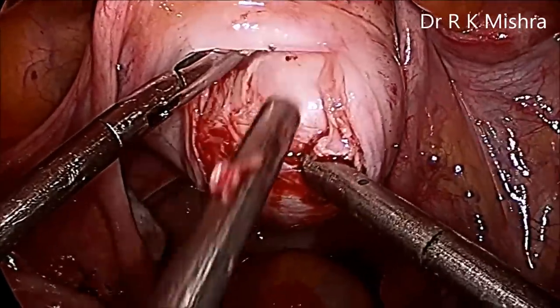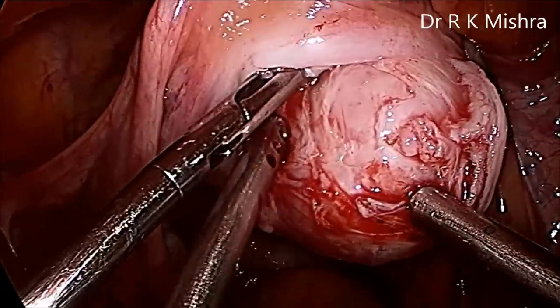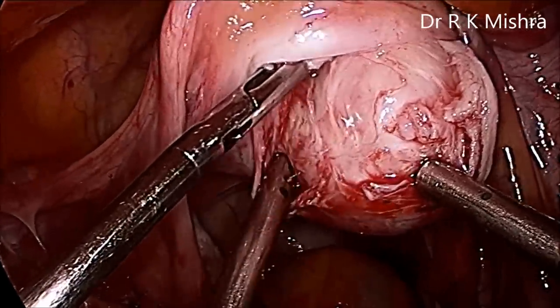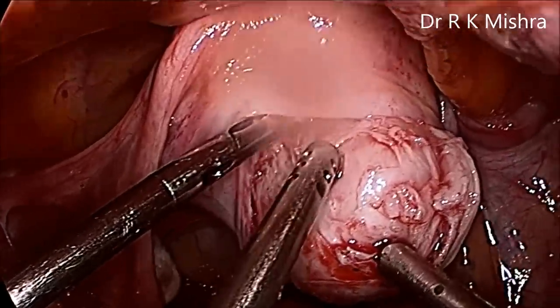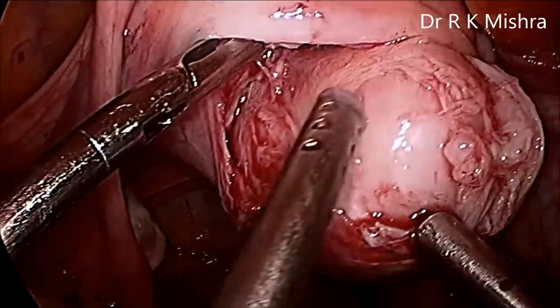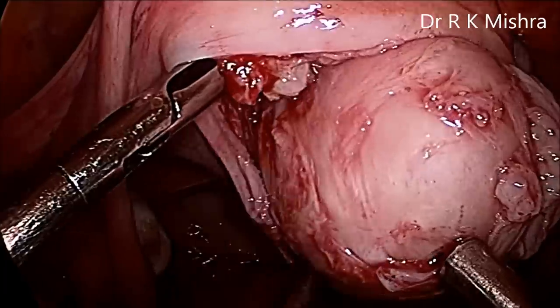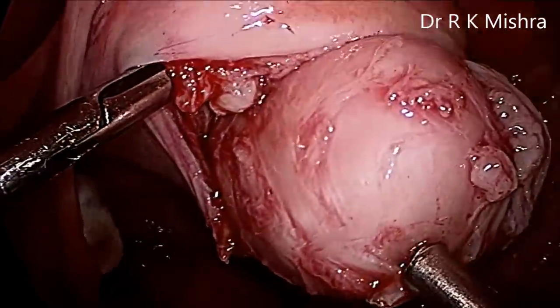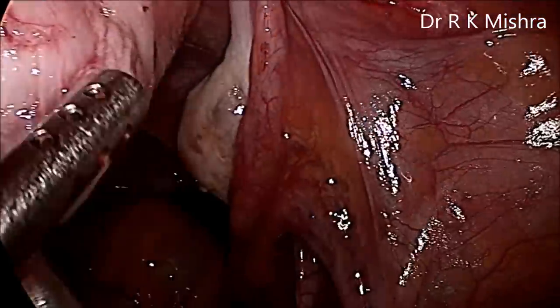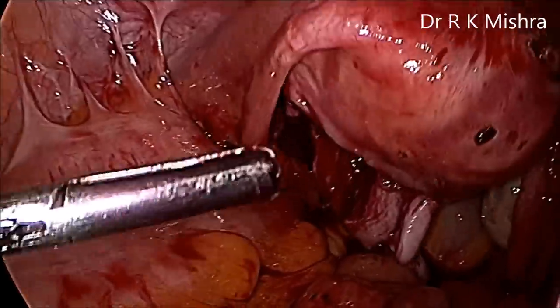You can use one suction irrigation to provide proper enucleation so that blunt dissection can be performed, which will not strip the muscles — muscle fibers can be separated and a good plane can be achieved. The telescope is cleaned because a few drops of fluid had made it dirty, and further dissection is carried out. This is one of the disadvantages of laparoscopy — your instruments are straight and you don't have a finger. In robotic surgery, when we do myomectomy, you get finger-like dissection because the instruments are articulating. But now this fibroid is also separated.